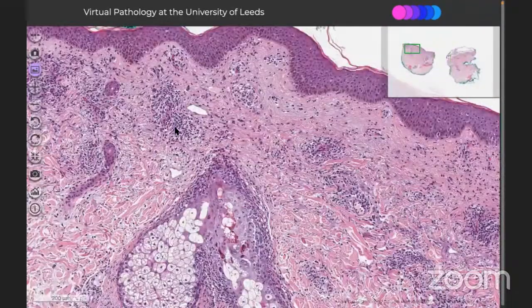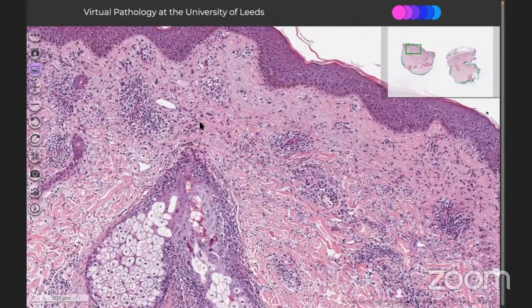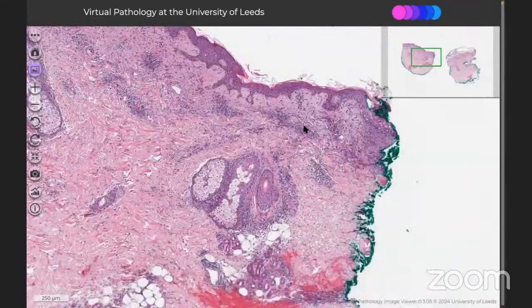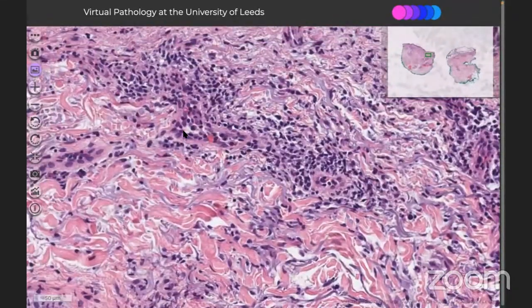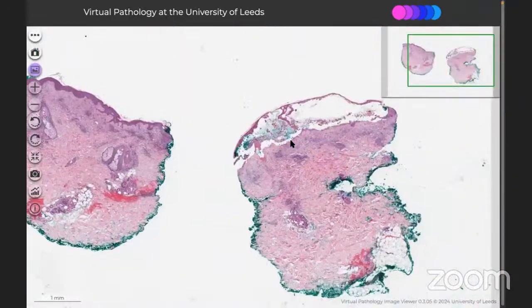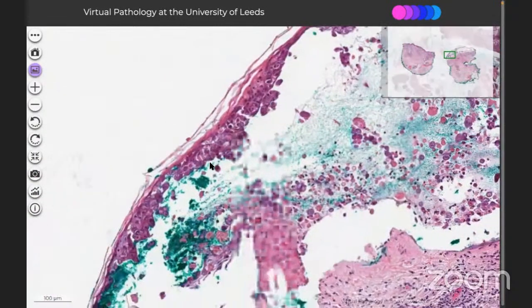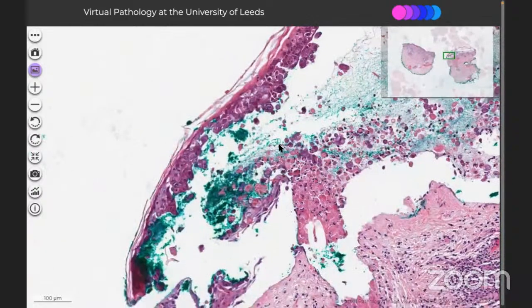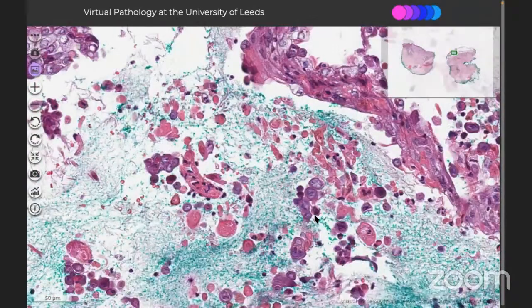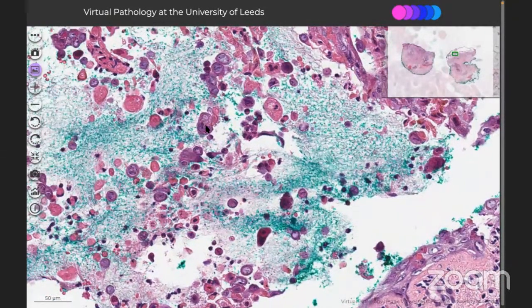And if you go onto the vasculature part, you can see there is quite a significant amount of vasculitis going on, and in a few of them there is also leukocytoclasia. So all these are part of this lesion. And then moving on to another block, if you concentrate on the cellular features, there is acantholysis, there is multinucleation, there is molding.